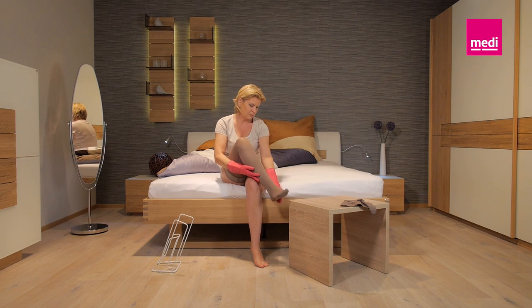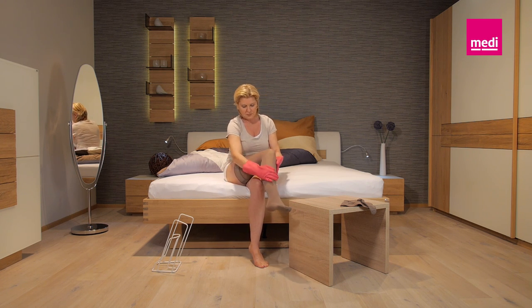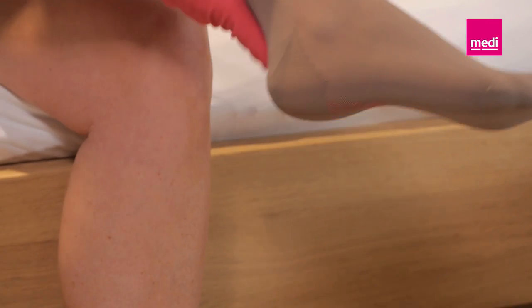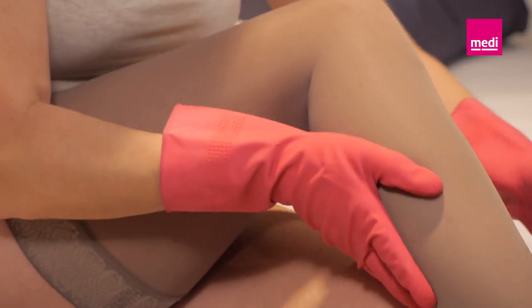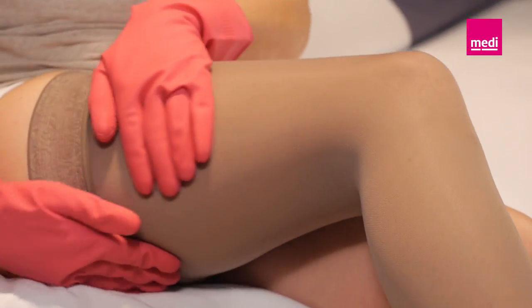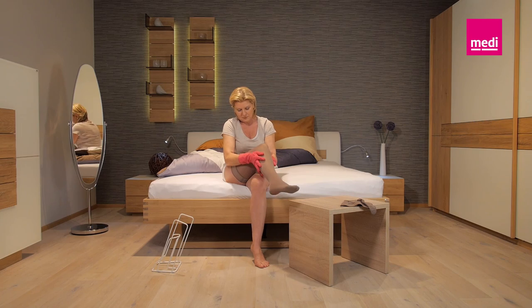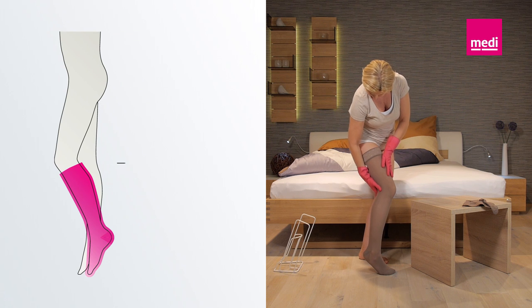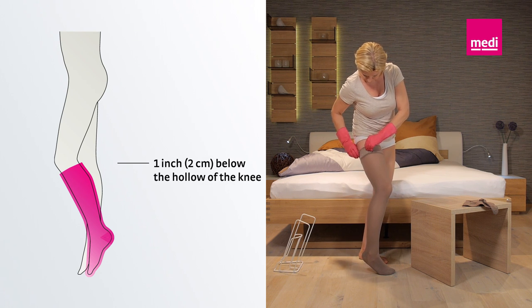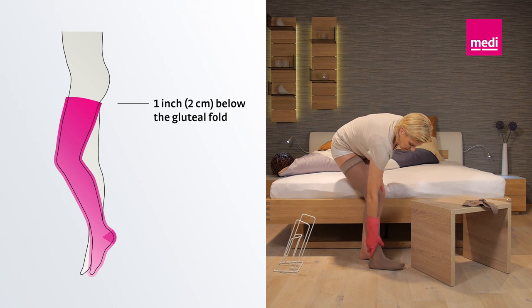It's best to wear Medi's rubber gloves to do this. They adhere particularly well to the material and help you to put the stocking on and smooth it out. Depending on the material and stocking length, you can push the material back and forth with the rubber gloves or hold the stocking with your fingertips. Lift it up and reposition it. Check that the whole stocking, the heel, and the cuff or top band fit properly. A knee-high sock ends about an inch below the hollow of the knee. The top of a thigh-length stocking ends over an inch below the gluteal fold.